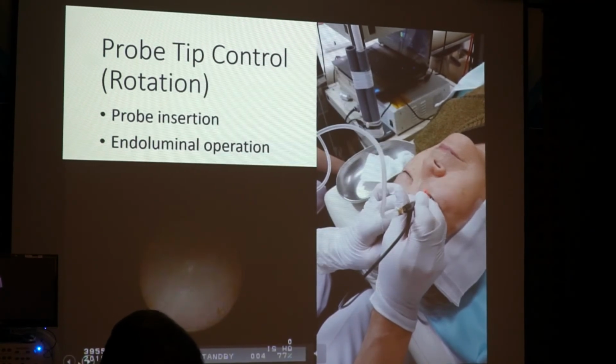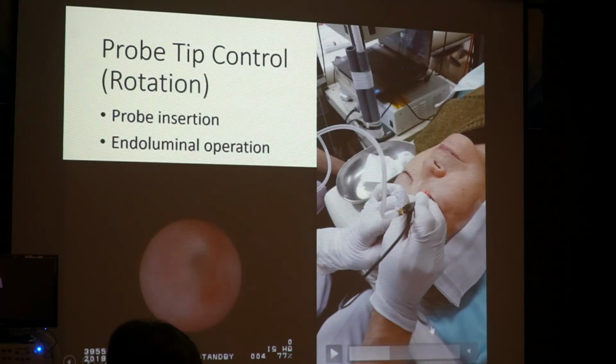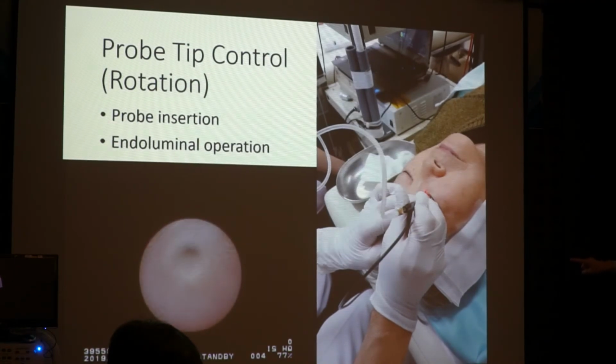And the left side video is a SEP video. Pre-op diagnosis was nasolacrimal duct obstruction. I'm getting into the lacrimal sac now. And what I can see is a pinhole, which is the entrance of the fibrous tissue. And what I'm doing is SEP. We can see the pinhole, so precisely I get into the pinhole like this.